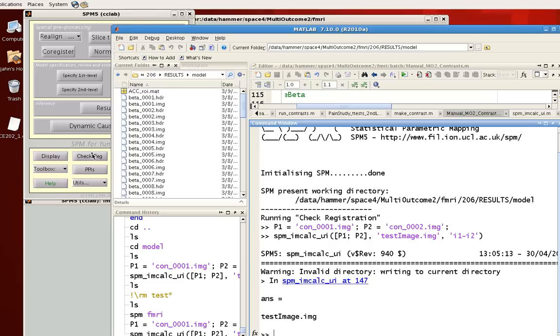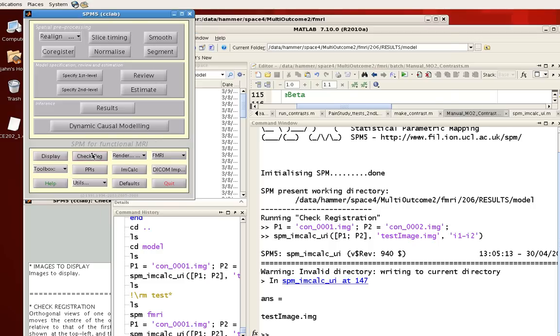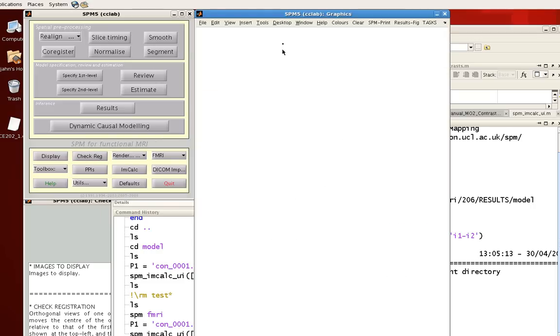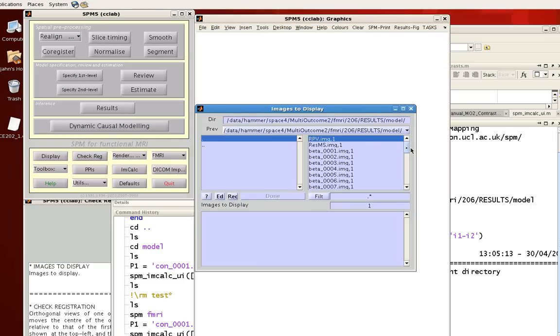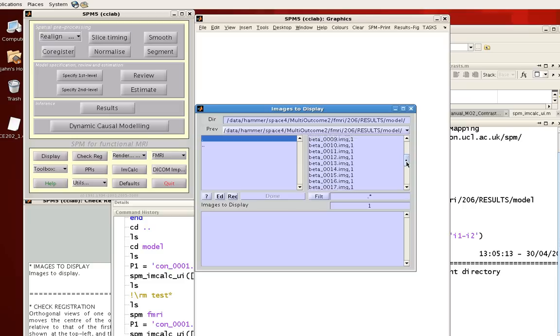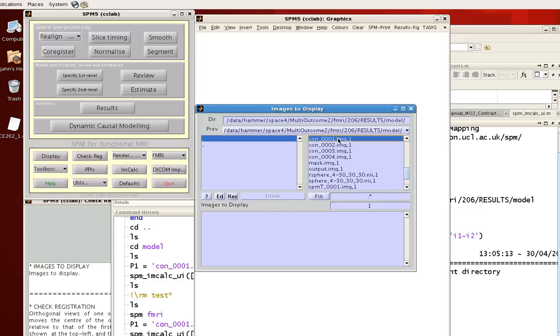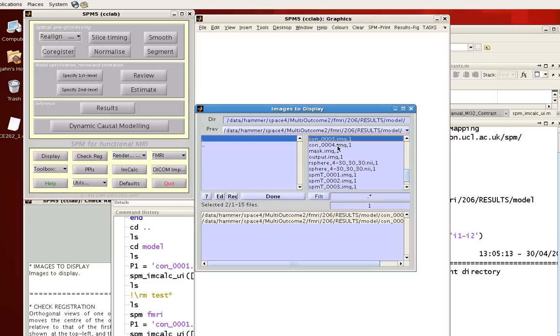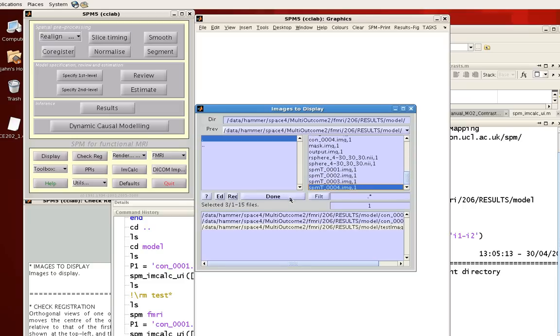Okay. Now to see how that actually changed things, I'm going to open up those two contrasts I had before. So CON1, CON2. And now my testimage which I output.